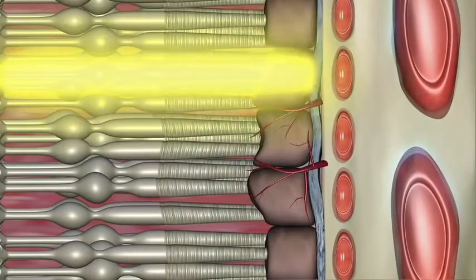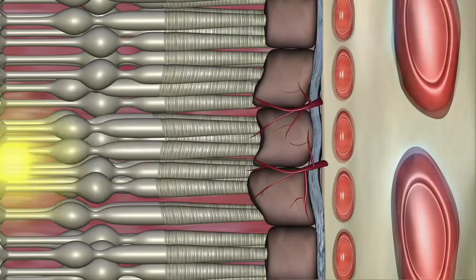A high-energy laser beam is aimed at the tiny, leaking blood vessels to seal them and to help stop them from growing.